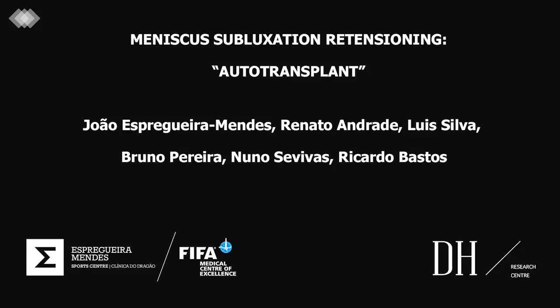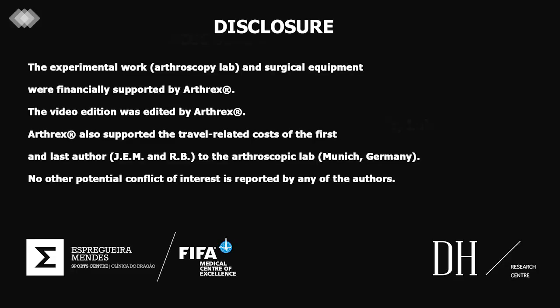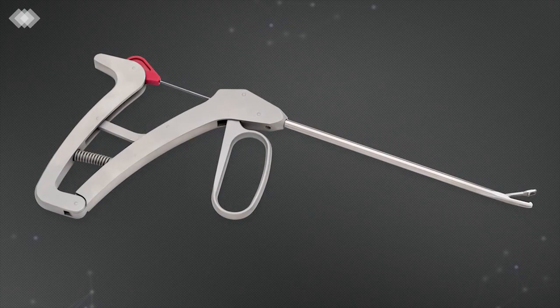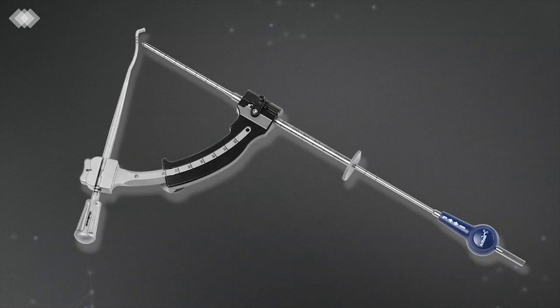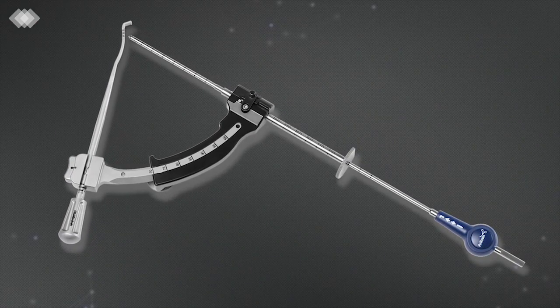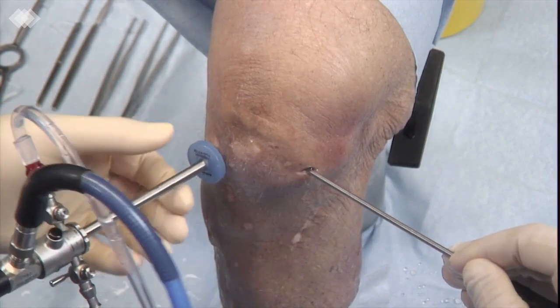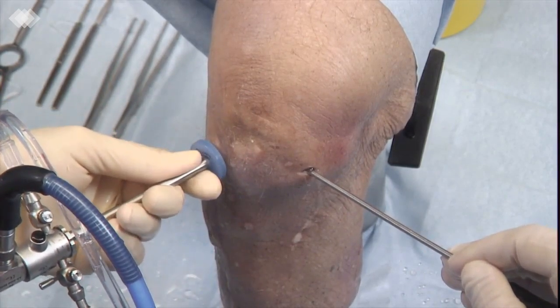This is an arthroscopic surgical technique developed for the treatment of meniscal extrusion observed in cases of early osteoarthritis. After conventional anterior-medial and anterior-lateral arthroscopic portals, a 10mm passport cannula is used to facilitate the procedure.